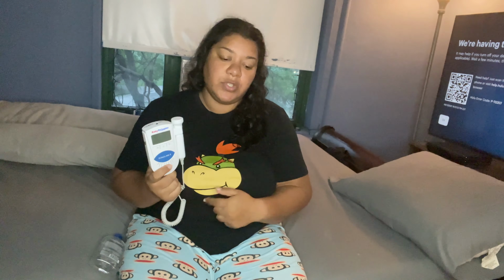Be patient. The numbers, when we first get his heartbeat, a lot of times he's 125, 126, which technically is normal, but me being me, I go into panic mode because usually his heartbeat is a lot higher. But it really depends on the spot you're in. It really depends what the baby is doing. It really depends if the baby is active in that moment. And it really depends where your placenta is.